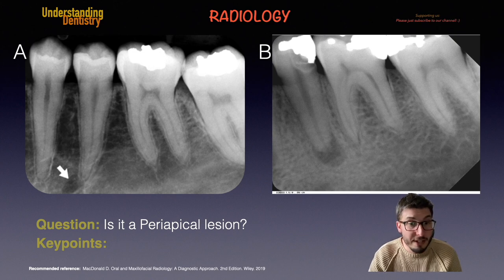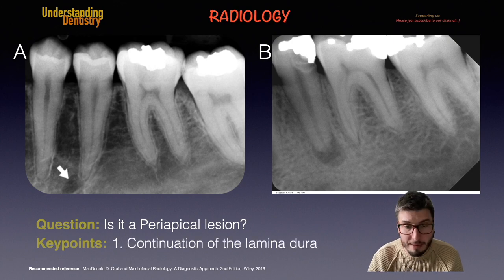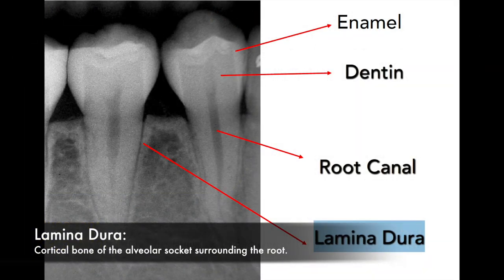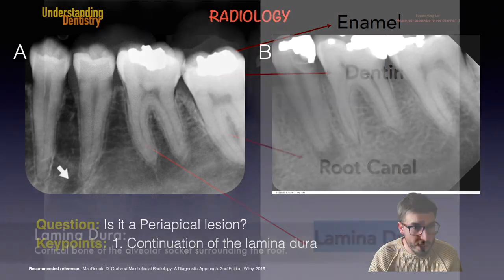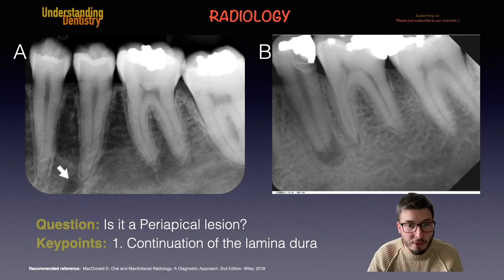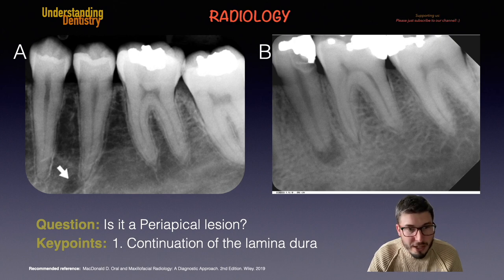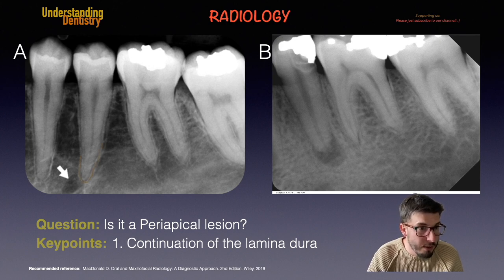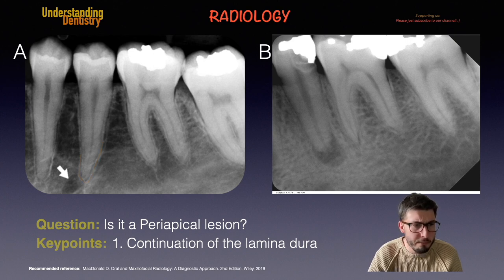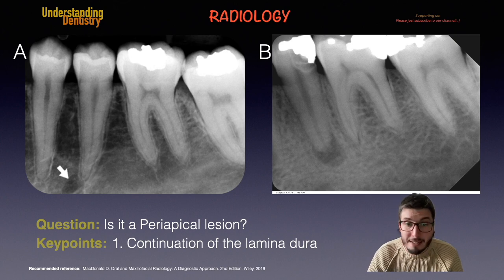Let's start with the first key point, which is the continuation of the lamina dura. We need to make sure that the lamina dura is surrounding the entire apex, because if it is, then it's not a periapical lesion. Looking at radiograph A on the left side of your screen, you can see a drawn line contouring the lamina dura. We can confirm that the lamina dura is surrounding the entire apex, which means the white arrow is not showing a periapical lesion.